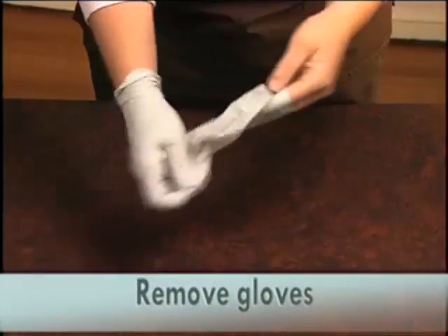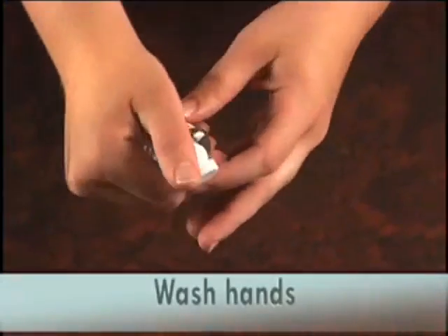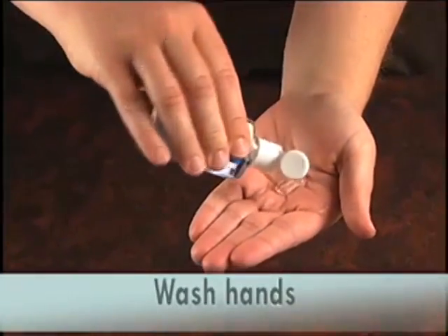Remove the gloves and throw the old dressing and gloves away. Wash your hands.